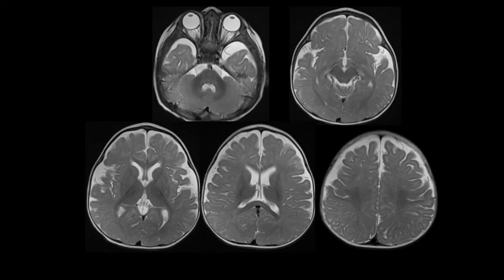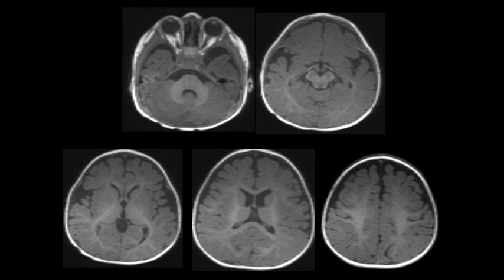At six months of age, this progression of myelination shows much more advancement, significantly more in the cerebellar white matter. The posterior limb of the internal capsule is fully myelinated now, and there is some myelination in the anterior limb of the internal capsule. Note that the splenium of the corpus callosum is also beginning to myelinate, and the genu is faintly myelinating at this stage. The pericentral areas are far more darker on T2-weighted images, indicating significant progression of myelination. T1-weighted images now show T1 hyperintensity in most of these areas, consistent with T1-weighted images being more advanced on the myelination front than T2-weighted images.